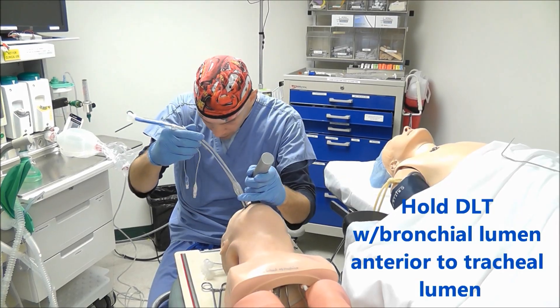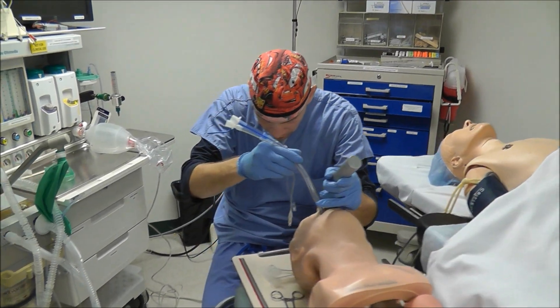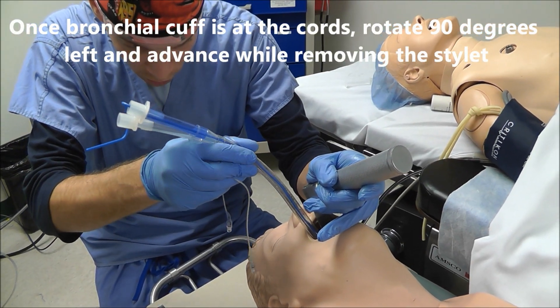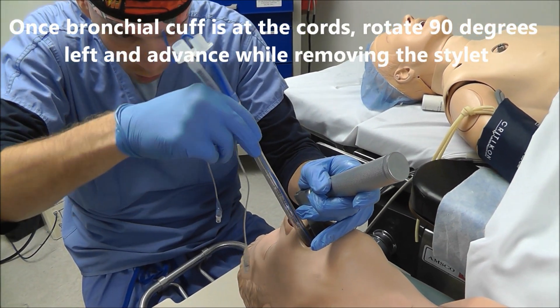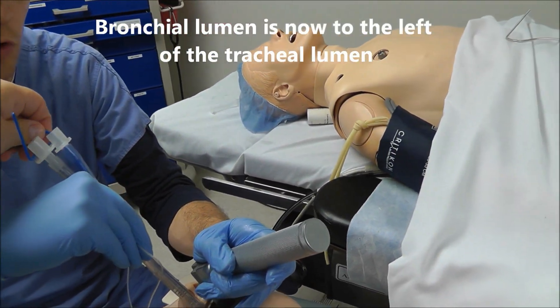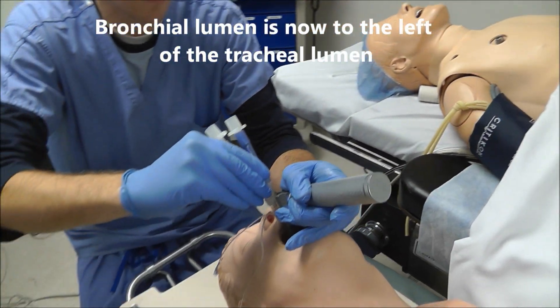Once we get our view, we advance until the bronchial lumen gets to the level of the vocal cords, and then two things need to happen. We need to rotate this tube 90 degrees to the left and have an assistant remove the stylet as we advance into the trachea.